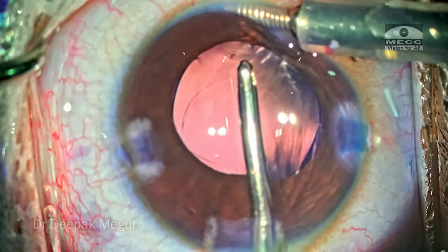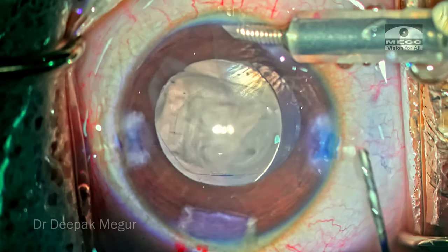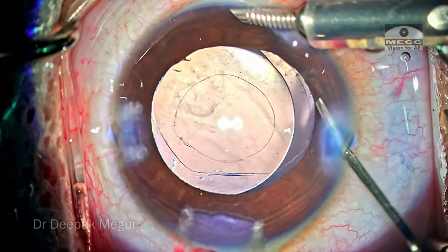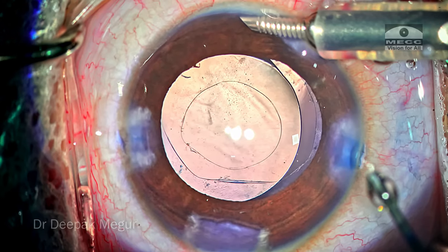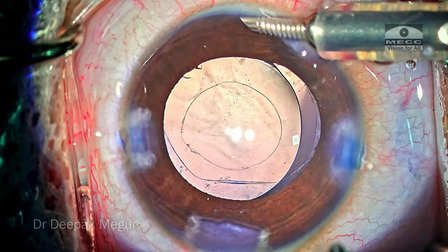The OVD in front of the lens is also aspirated out. Diluted triamcinolone acetonide is used to check for any remaining vitreous fibrils. I've also used diluted pilocarpine to bring the pupil down a little bit. The lens looks to be very well centered, as is the posterior capsule rhexis.